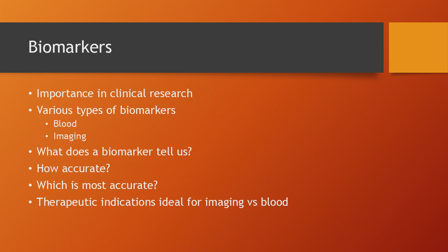It's a parameter that is demonstrating a real clinical utility, right? And what can an imaging biomarker tell us? Imaging biomarkers can help us to identify findings quantitatively that are not evident to the naked eye. So, for example, we can have diseases that to the naked eye of a radiologist in a core lab, for example, in a clinical research project with Alzheimer's disease, we can have a case that has no atrophy, apparently, in the brain.